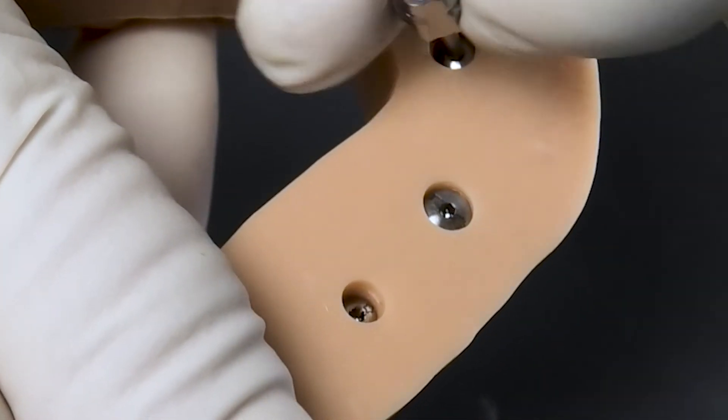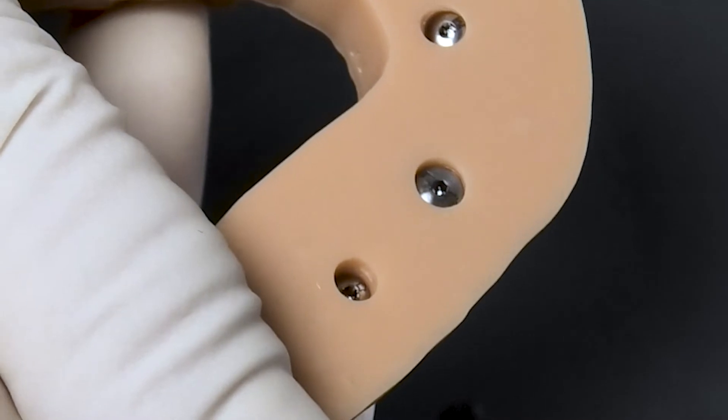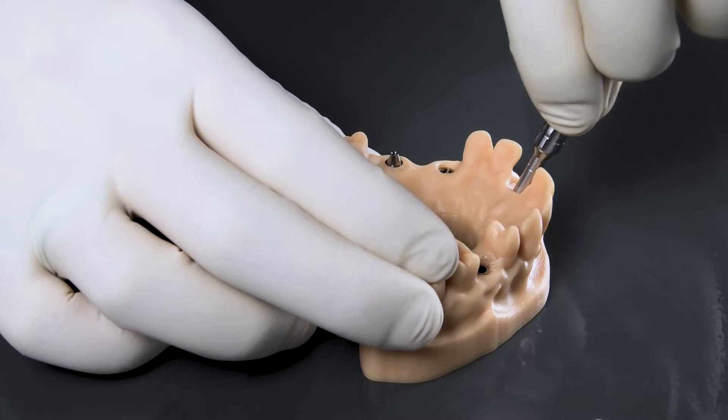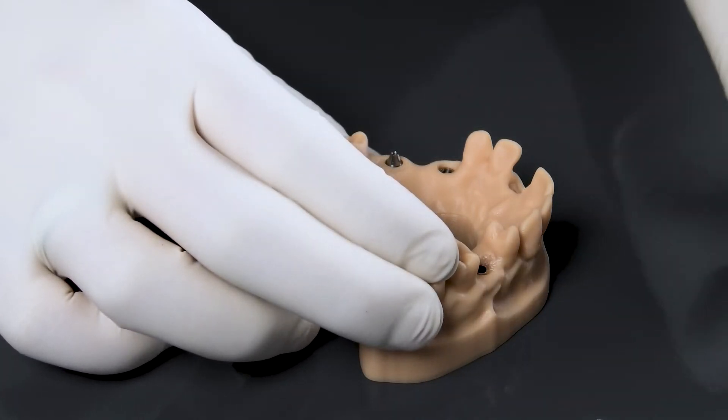In order to ensure a secure and firm fit in the printed model, the Tealogic TwinFit laboratory implant is fixed from apical by a counter screw.